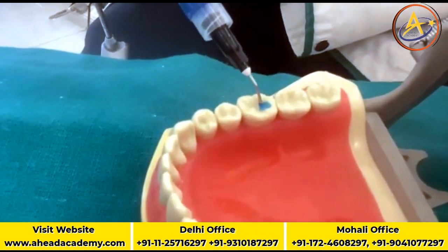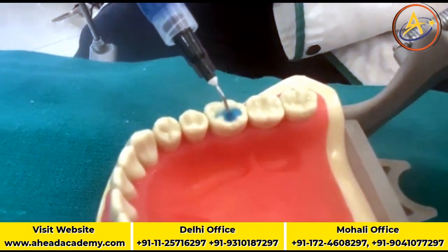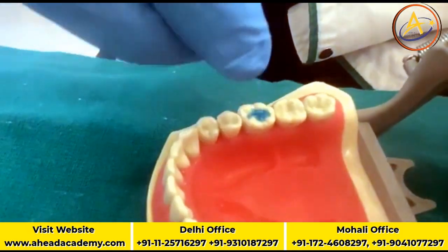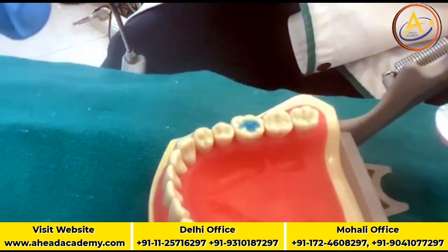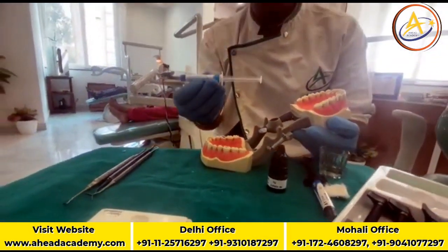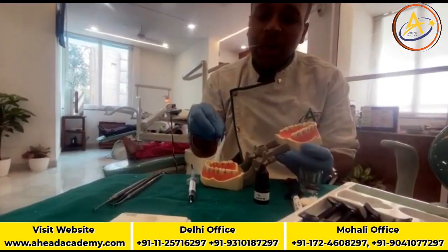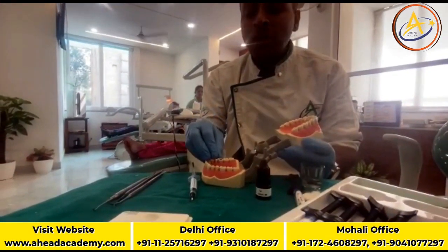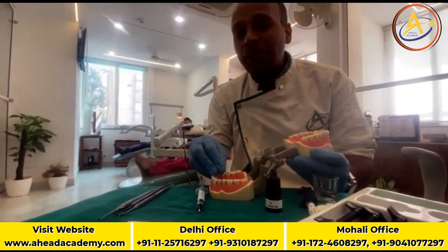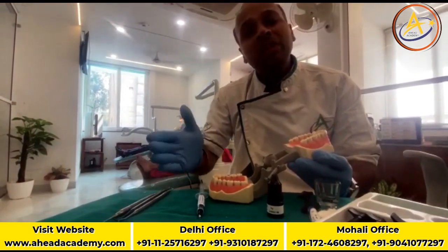Now again, etchant comes in the gel form and the liquid form. Gel form is always preferable, like I am using the gel form, because if we apply the liquid form, it flows through the unnecessary areas which you do not want to etch. So always go with 37% phosphoric acid in the gel form. Now the question arises, for how much time should this etchant remain? The answer is a minimum of 15 seconds. And if you go with Phillips, it says 20 to 30 seconds.